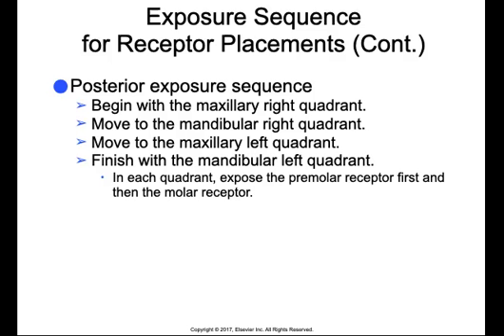So we'll begin with the maxillary right quadrant, then we'll move to the lower right quadrant, move over to the upper left quadrant, and then finish with the lower left quadrant. In each quadrant, we want to expose the premolar receptor first again, and then the molar receptor.